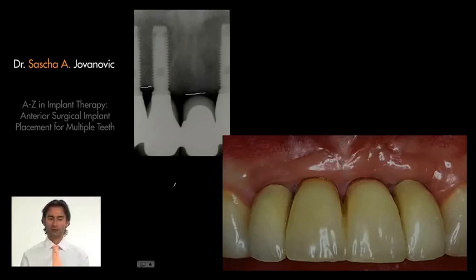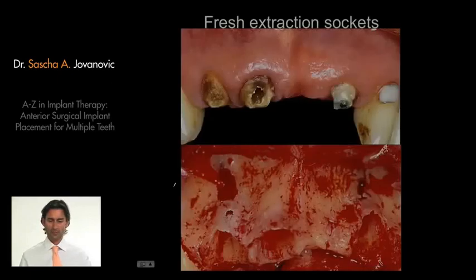And here the 4-unit bridge demonstrated here in the anterior, showing you how nicely the ovate pontic emerges from the tissue and still giving that good aesthetic result. So this is possible for patients like this, and it gives us a good option to get still anterior implant rehabilitations, but with a good aesthetic result. Now I would like to demonstrate to you the other treatment option, which I think is good.